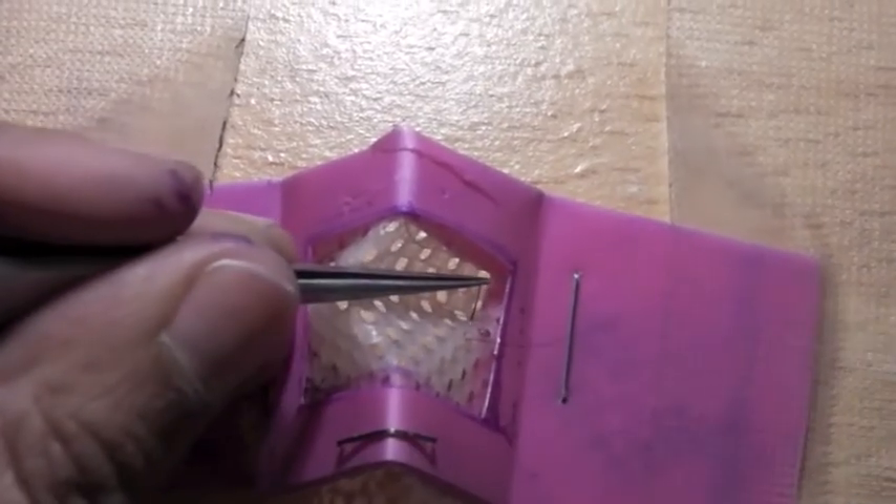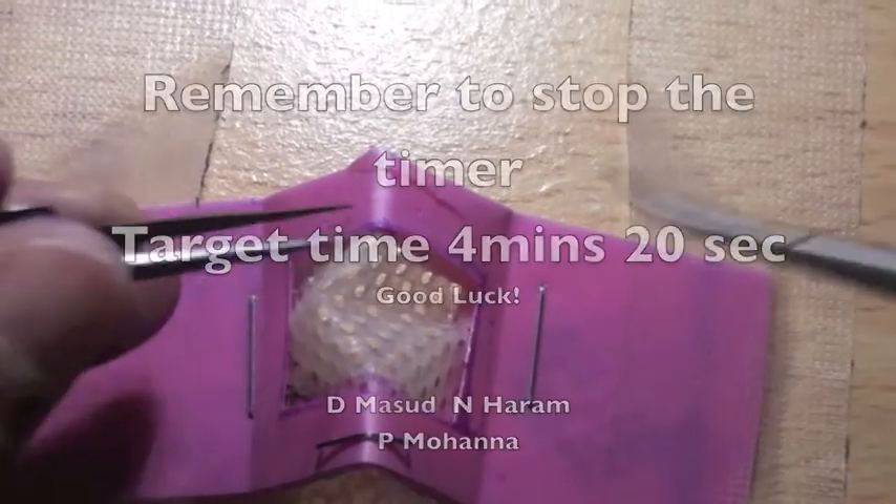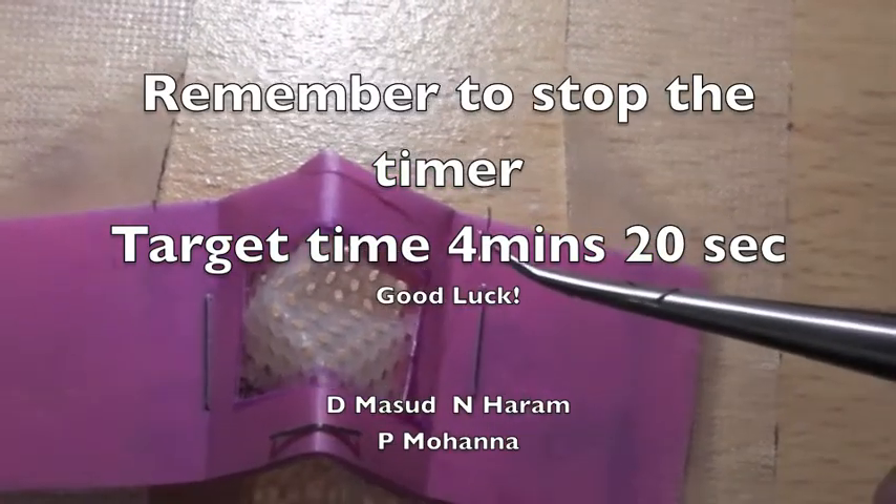As you're nearing the end, remember to press stop on your timer. Good luck! And then it's done.